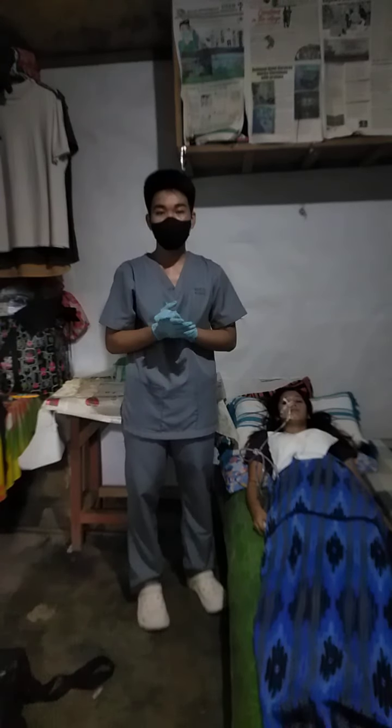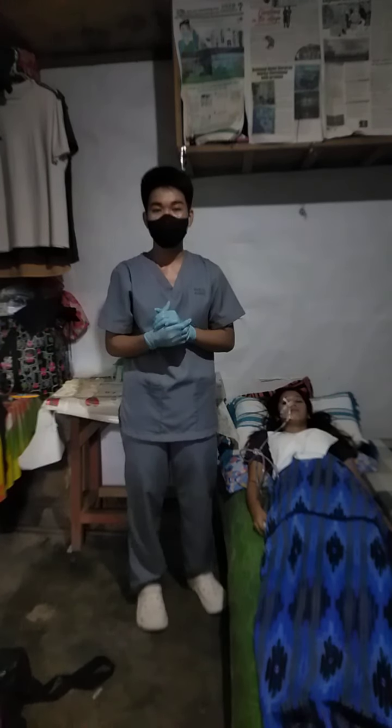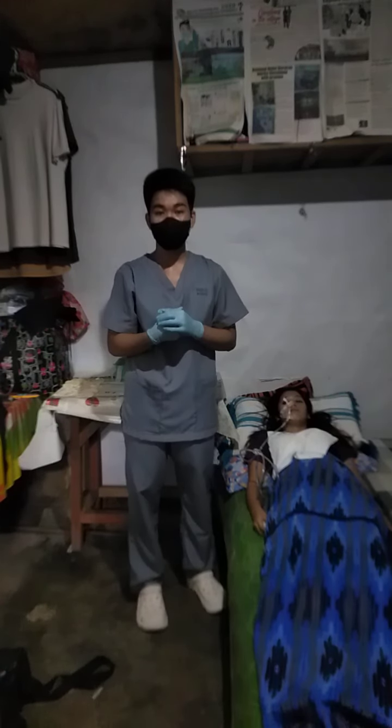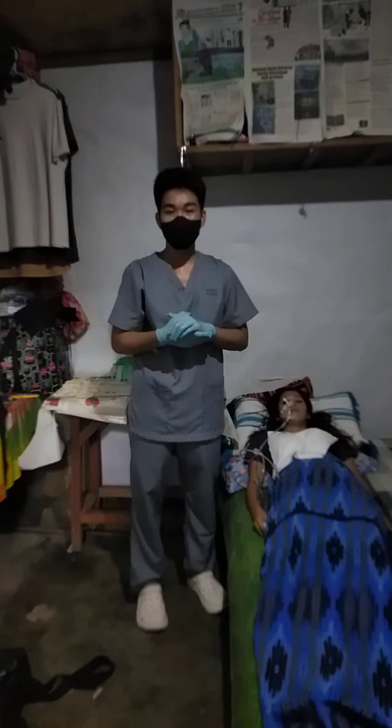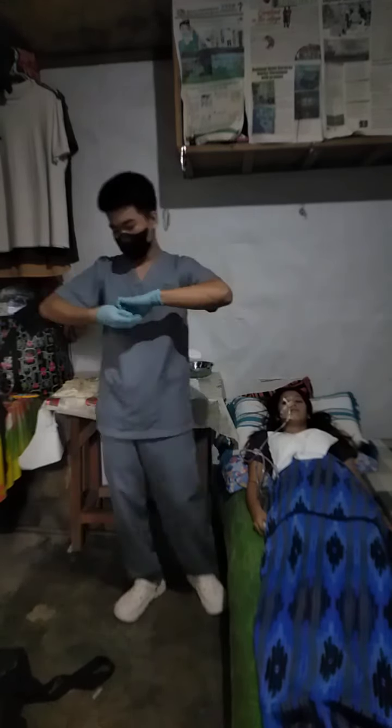To secure with tape, a skin barrier improves adhesion and protects the skin, because constant pressure of the tube against the skin and the mucous membrane may cause tissue injury. So, remove gloves.